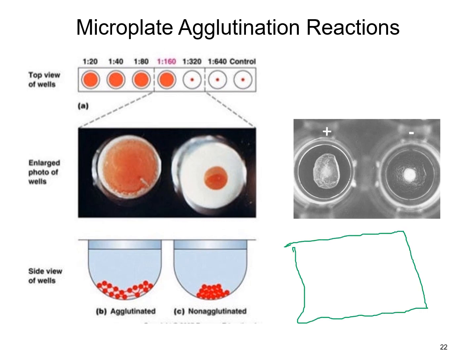And so basically you would have this portion here within this little microplate. So you're just going to have all of these little wells. And then you're going to add a very minute amount. The fact that it says it's a microplate means you're using a very small amount of reagent and sample.